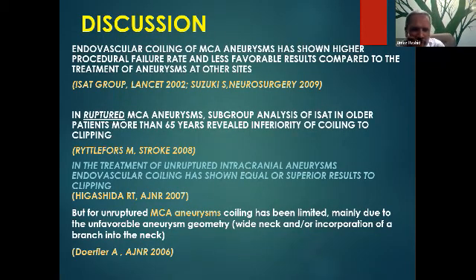In the discussions, as there are so many people, very few are in favor of doing simple coiling, and I'm one of those. But at the same time, I'm not against stent coiling, but I prefer to do simple coiling, or in some cases simple flow diverters. Yes, in a few cases we have to occlude the artery, like a giant aneurysm. Then, of course, there's no need for putting in a stent. We just have to do simple coiling, clear of the parent artery, which we do in giant aneurysms.